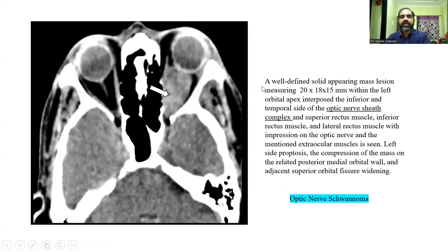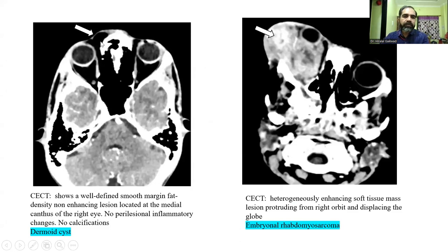In this image, there is a well-defined solid mass lesion in the orbital apex involving the optic nerve complex. This was a case of optic nerve glioma. This CT image shows a well-defined, smooth-margined, fat-density, non-enhancing lesion located at the medial canthus of the right eye. This was a case of dermoid cyst.